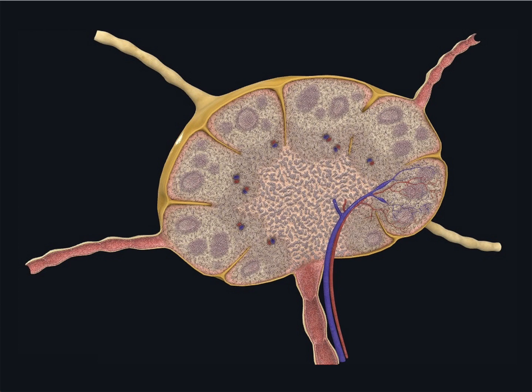Lymph nodes are widespread, but more concentrated in the axilla, the groin, and the mesenteries. I'm going to show you a lymph node from the mesentery and also one from a series of nodes near the bronchus and hilum of the lung.